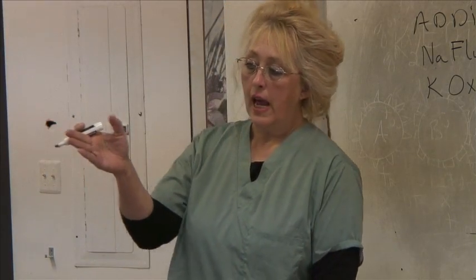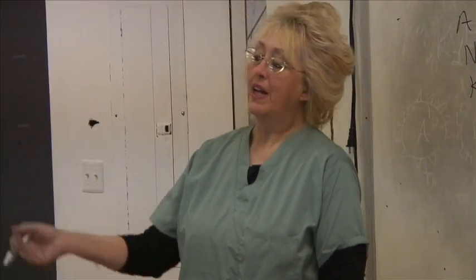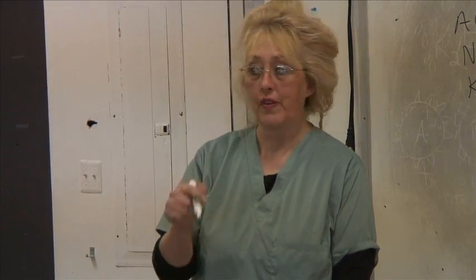So in your lab sheet, your columns 1 through 5, all those are serum separator tubes, right? If any of those were stat, I would use a green. And I would be careful which green I choose so as not to elevate falsely the sodium levels, right? If I had a test that I was looking for sodium. But if you have a stat CBC or you have a stat type and cross, all you're going to do is put a stat sticker on those. And you can't make up the stat sticker. You can't decide if something's stat. A doctor has to write the order. For instance, if I think something should be stat, I will run it stat, and then I have to call the doctor and ask him to give me an order for that stat.